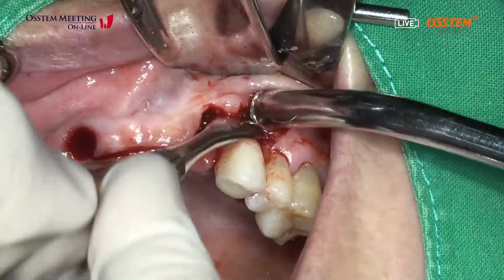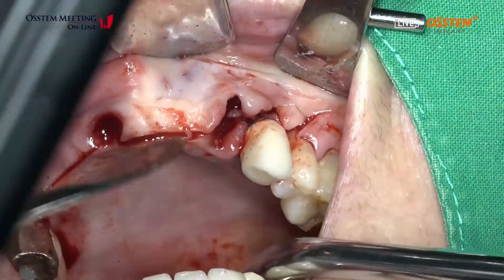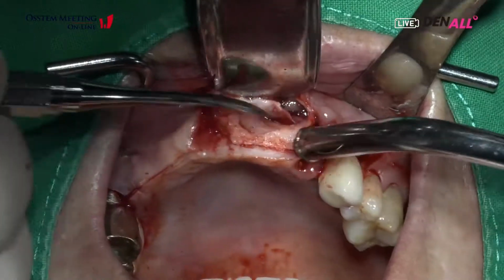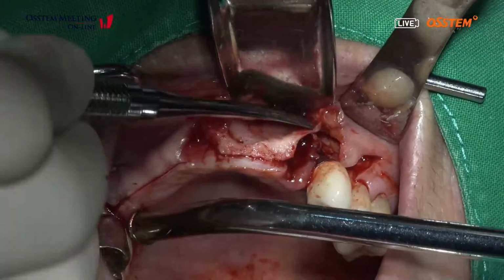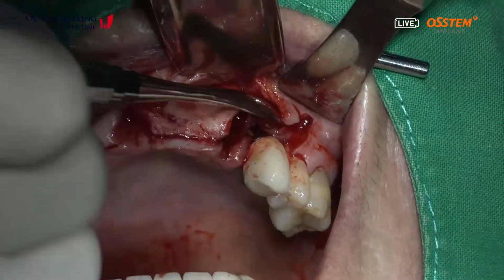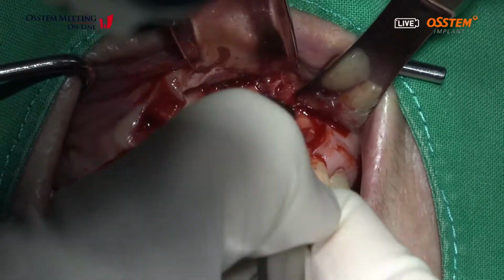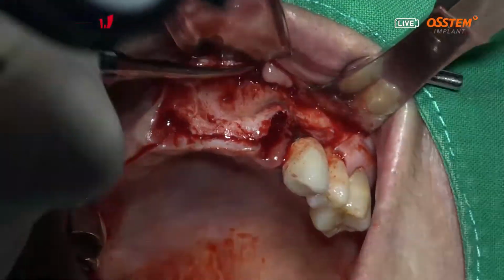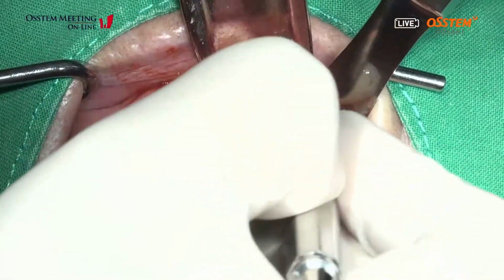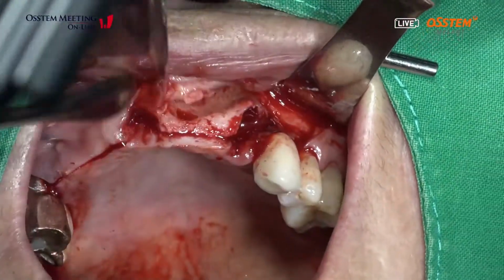So you can see the severe bone deficiency here around canine.